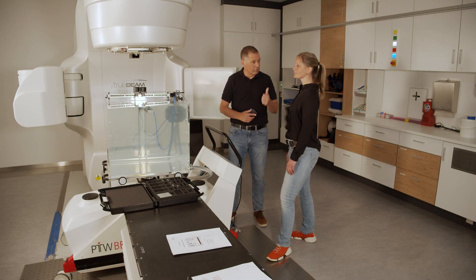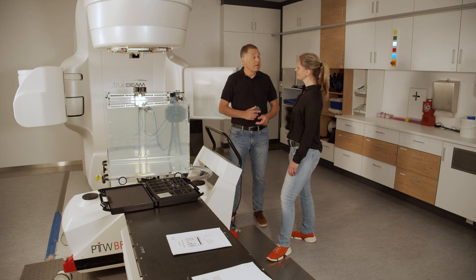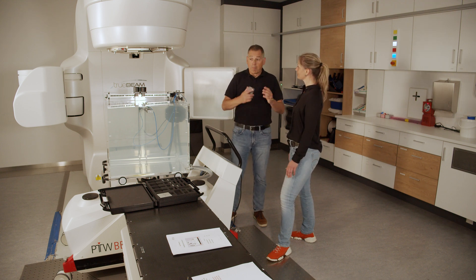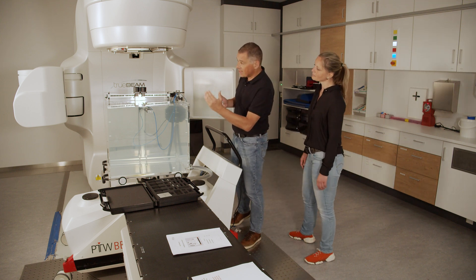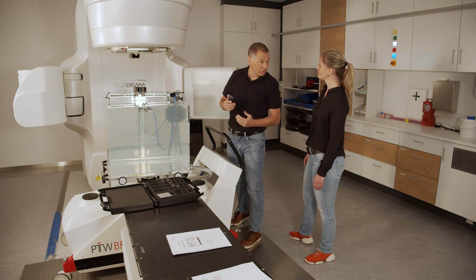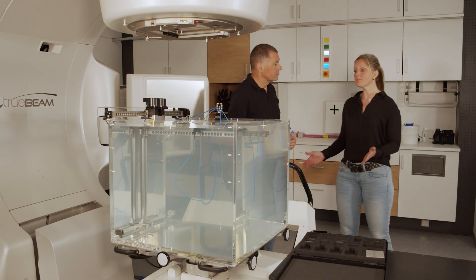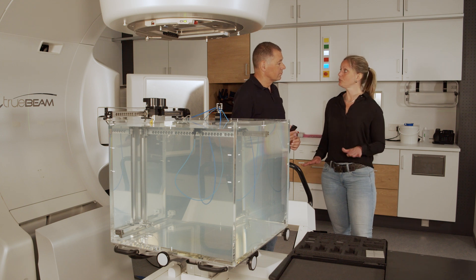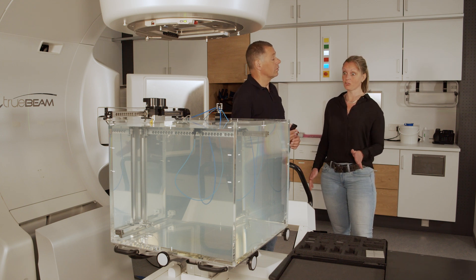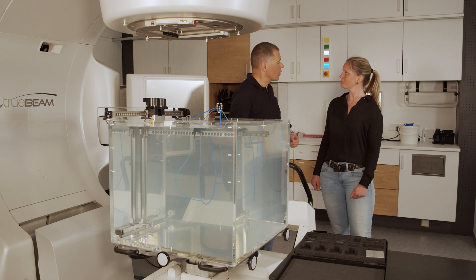Okay, now we have carried out a reference run. We have adjusted the SSD. We have pumped in water and we have leveled the BeamScan. But the position of the BeamScan water phantom is still shifted in relation to the accelerator. Yes, you're absolutely right. BeamScan will do this automatically too. It measures the beam, determines possible offset deviations or rotation, and translates it into a virtual coordinate system.